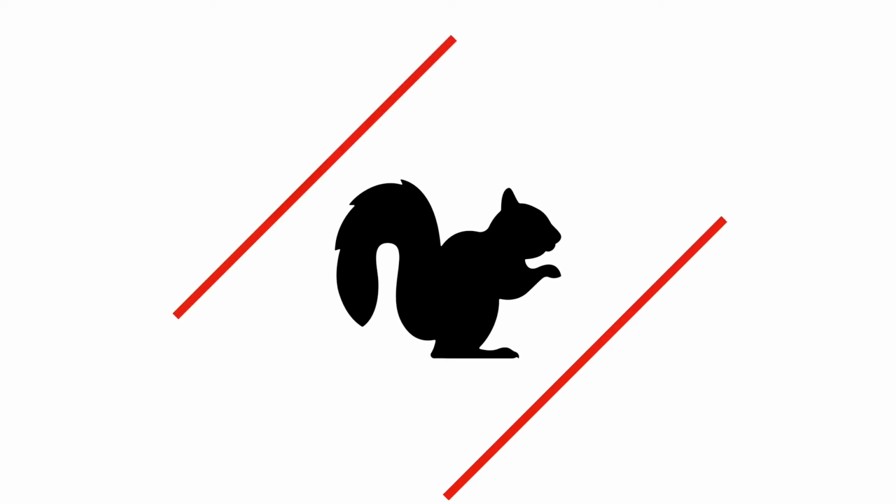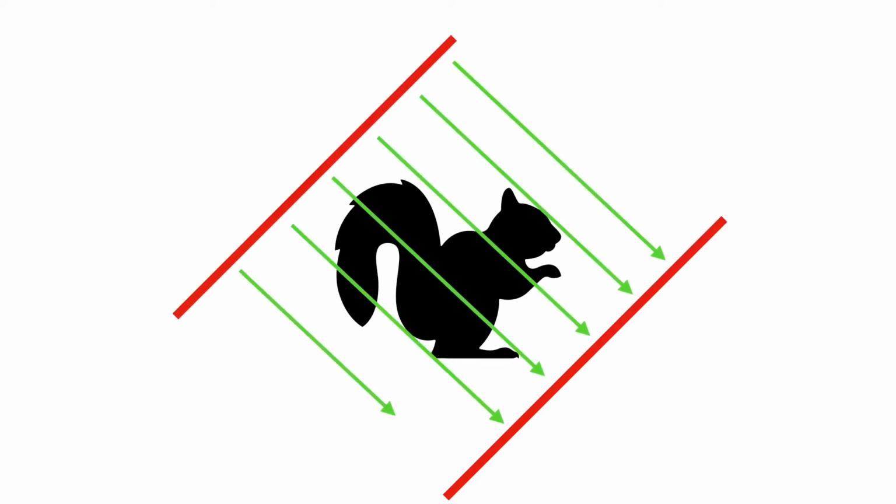This is our patient today, a squirrel. We want to take a computed tomography image of our patient, so we add the device and expose our patient to X radiations along straight lines. The way we can now image the squirrel is by looking at how much radiation is measured on our receiver plate on the right. The signal we measure depends on tissue density.